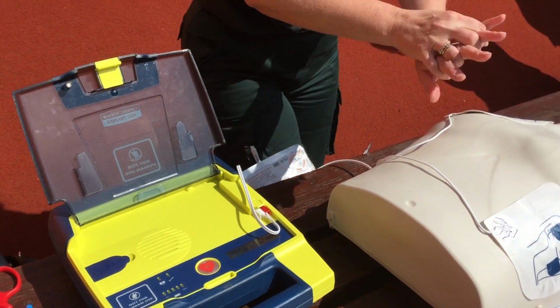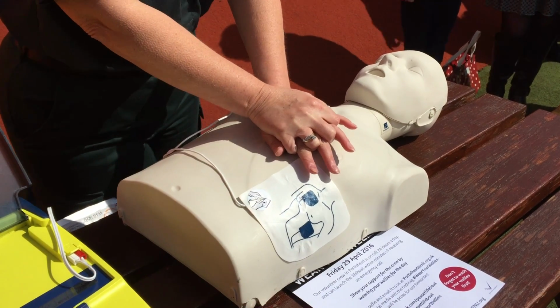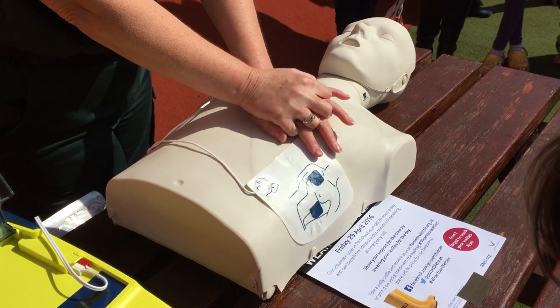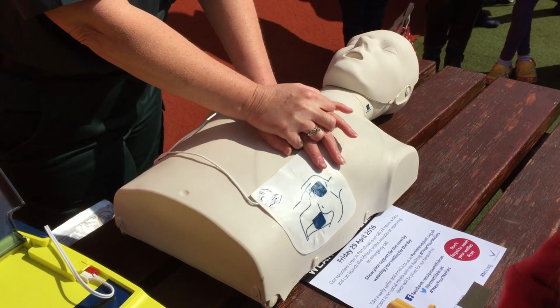So as soon as it tells you it's safe to touch the patient, you are now on the chest. Start CPR. Give 30 compressions, then give 2 breaths. And you will keep going now for 2 minutes. Okay? Keep going. Don't stop for 2 minutes.